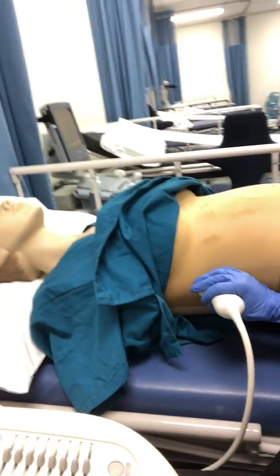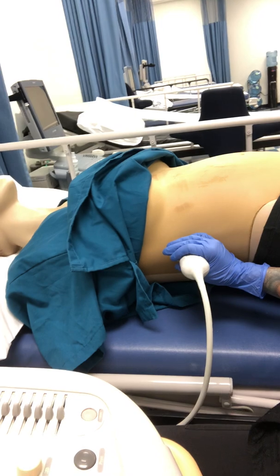So again, if we're in the sagittal aspect coronally, the notch will point towards the patient's head.